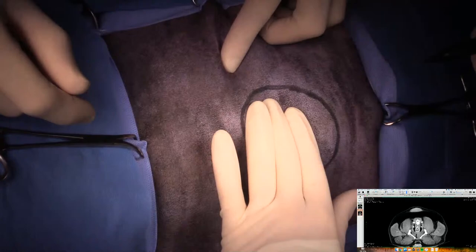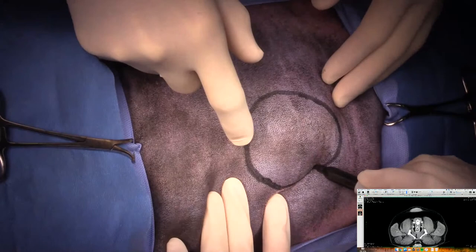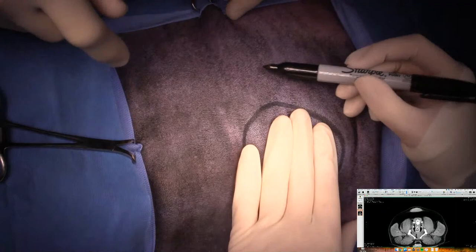I think you probably overestimated a little bit on that, so I think you only need to go about 2 centimeters outside of that. And make it elliptical.